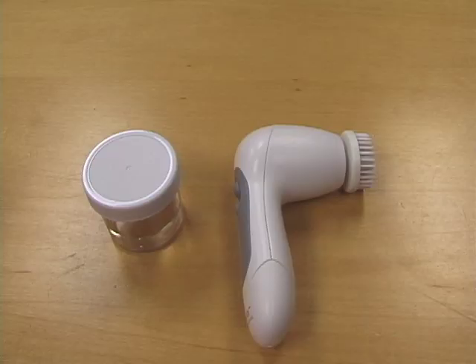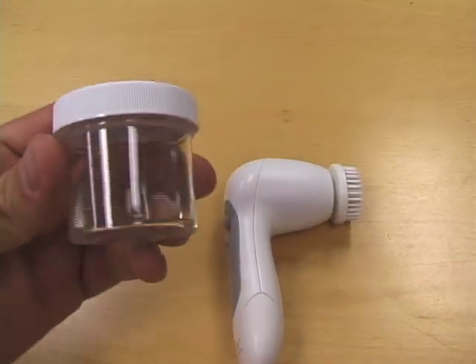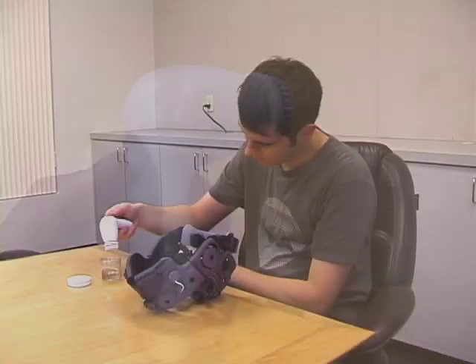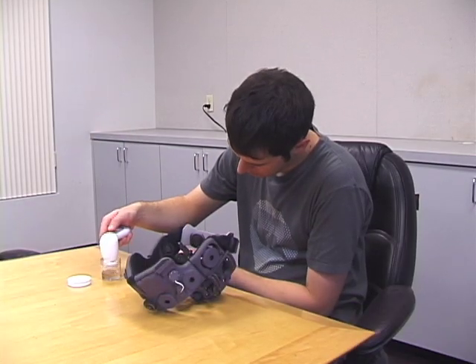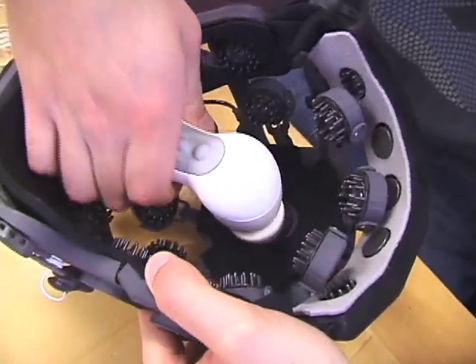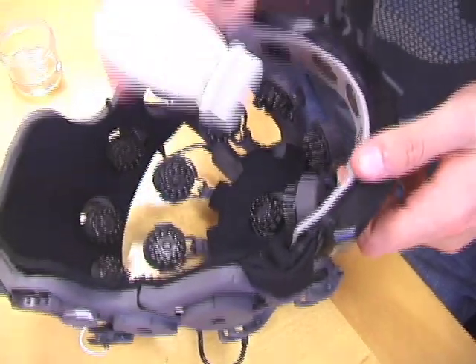Between users, the headset should be cleaned with 70% ethanol or isopropyl alcohol using the supplied motorized brush. Apply just enough fluid to the brush to clean the electrodes without overly soaking them. After cleaning all electrodes, brush all interior surfaces that make contact with the user.